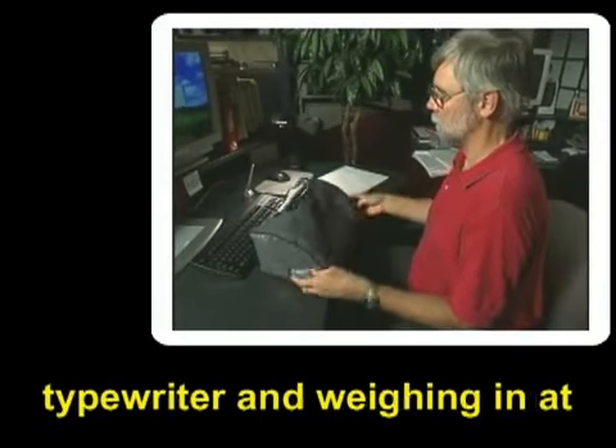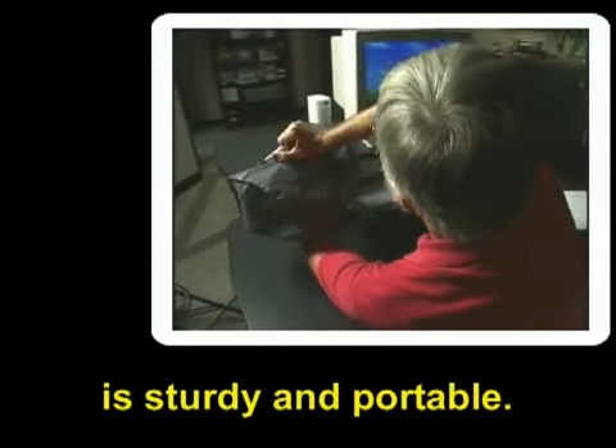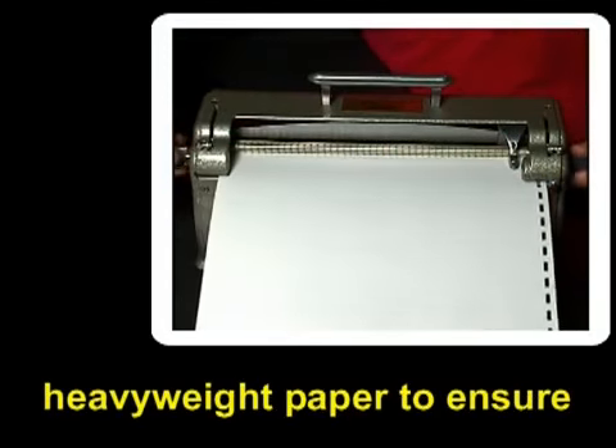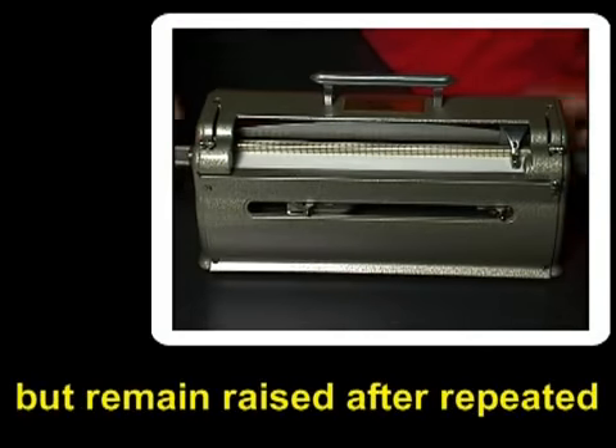Mechanically similar to a manual typewriter and weighing in at about 10 pounds, this device is sturdy and portable. The device is often used with a heavyweight paper to ensure that the dots don't flatten out, but remain raised after repeated use.